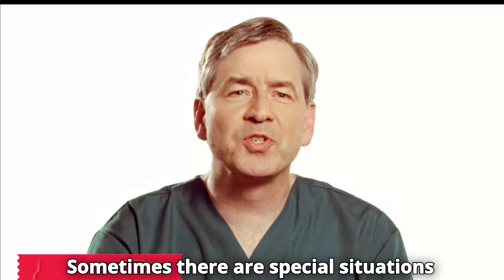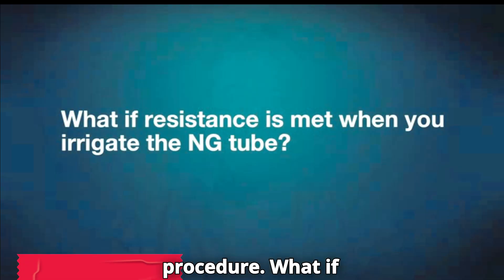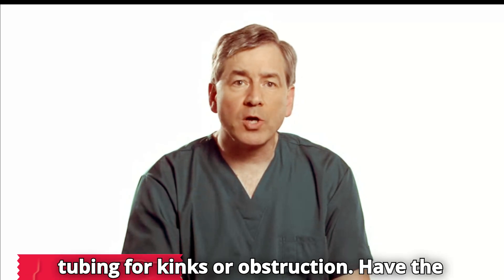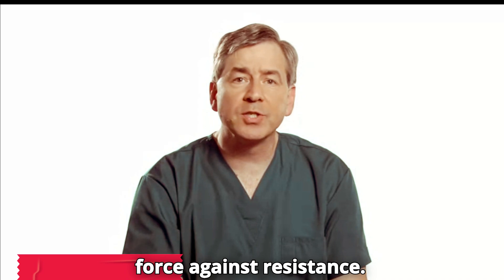Sometimes there are special situations you will encounter during the procedure. What if resistance is met when you irrigate the NG tube? Check the tubing for kinks or obstruction, have the patient turn to her left side, and do not force against resistance.